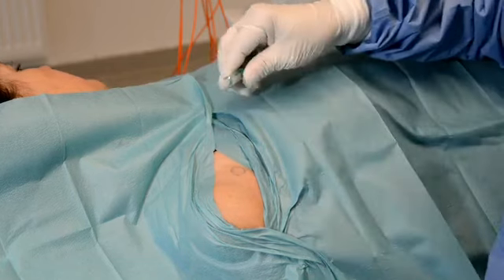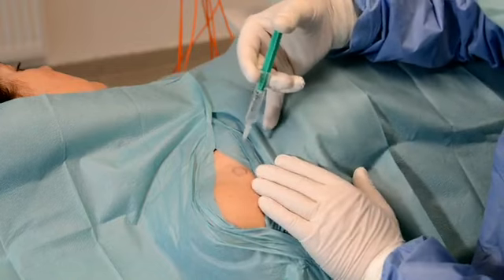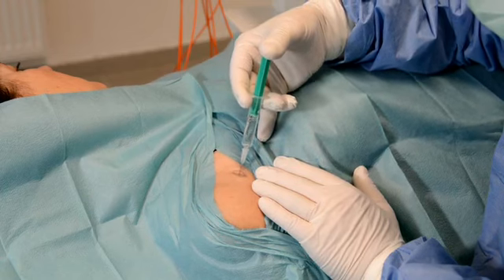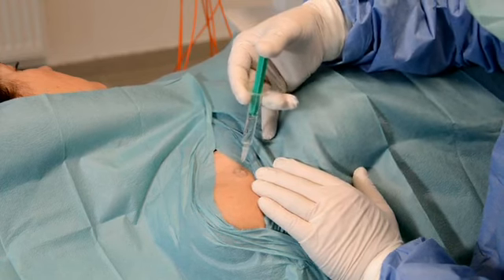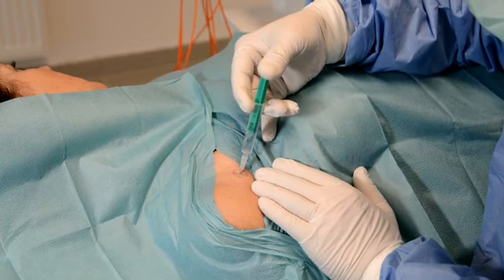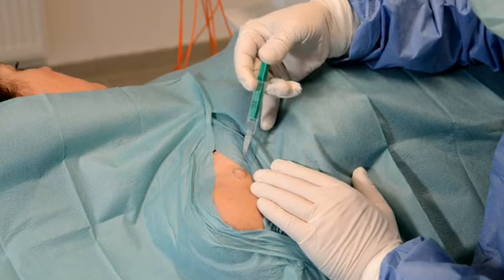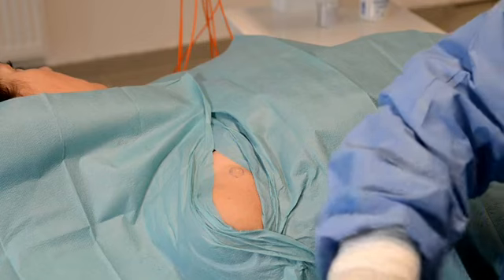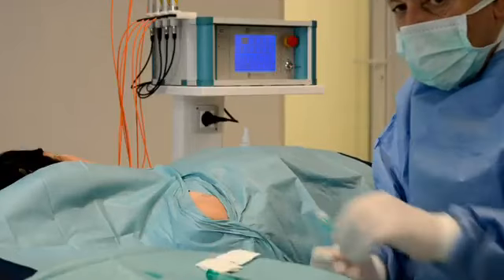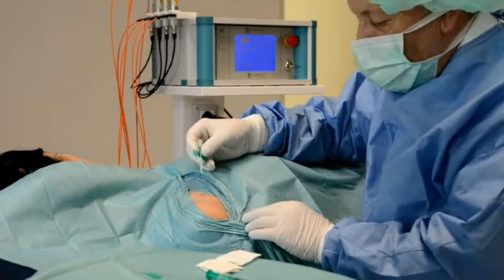First step now is our local anesthesia, which is a normal procedure in our daily practice. So again, we push the needle forward and pull it back under injection of the local anesthesia. Normally we wait a minute till the anesthesia is working, and now I will insert the butterfly needle on the pain area.